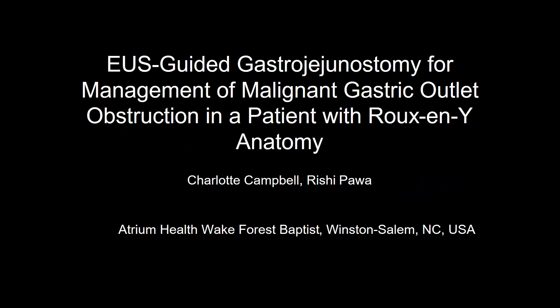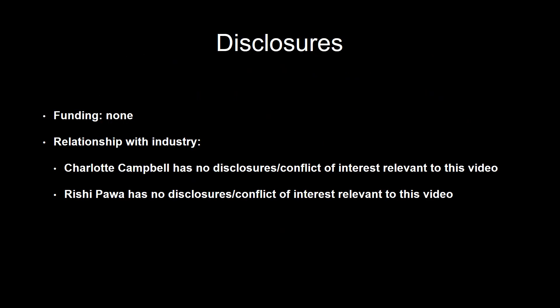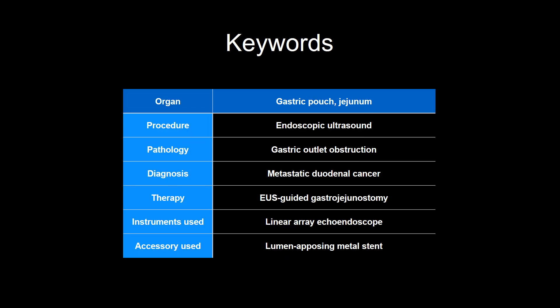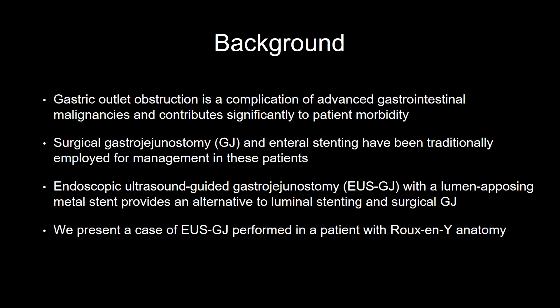EUS-guided gastrojejunostomy for management of malignant gastric outlet obstruction in a patient with Roux-en-Y anatomy. Gastric outlet obstruction is a complication of advanced gastrointestinal malignancies and contributes significantly to patient morbidity. Surgical gastrojejunostomy and enteral stenting have been traditionally employed for management. Endoscopic ultrasound-guided gastrojejunostomy with a lumen-apposing metal stent provides an alternative to luminal stenting and surgical gastrojejunostomy. We present a case of EUS-guided gastrojejunostomy performed in a patient with Roux-en-Y anatomy.